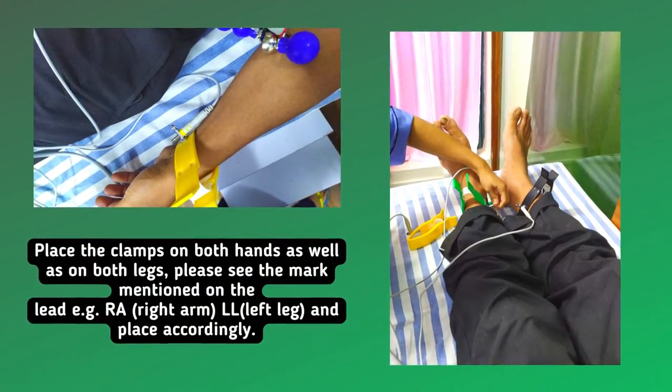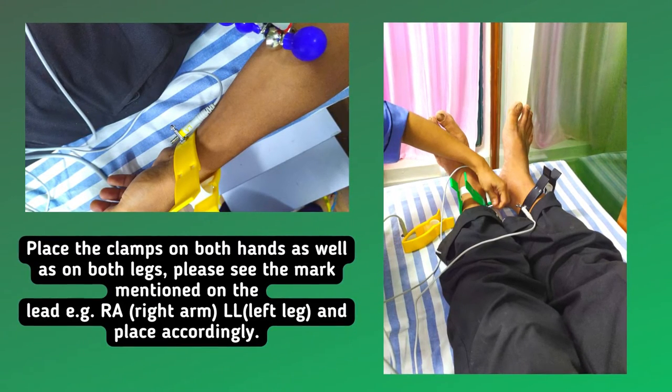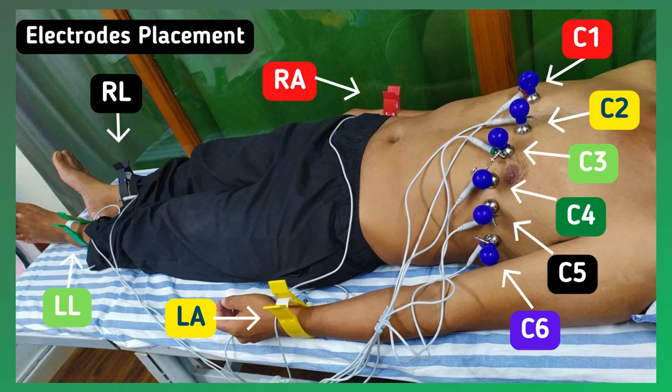Place the clamps on both hands as well as on both legs. Please see the mark mentioned on the lead, example RA, right arm, LL, left leg, and place accordingly. The final electrodes placement will look like this.